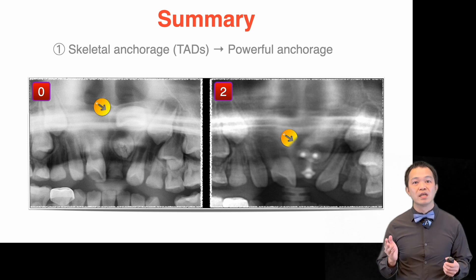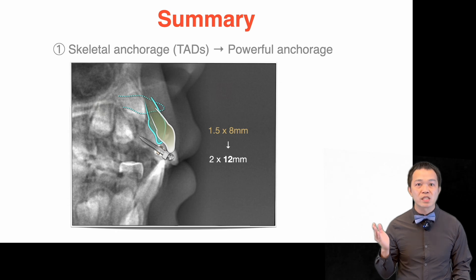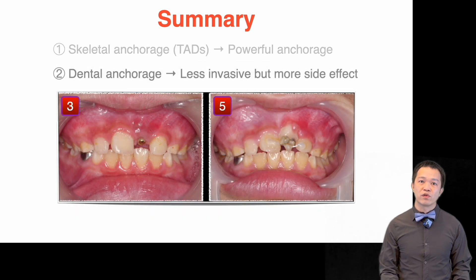To summarize this case: skeletal anchorage worked very well. If I had chosen a longer mini screw, the initial surgery and traction period would have been less than five months. Dental anchorage for traction was also effective, but had the side effect of affecting the adjacent anchorage teeth.